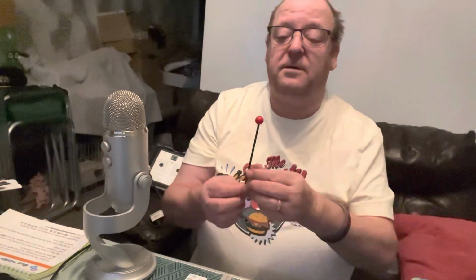My next instrument is a fixation target. You've got a nice large red one, or you've got a small red target, and it helps during an eye examination. So it's, look, follow the target up to your left, down, central, that helps to see how good your field of vision is.